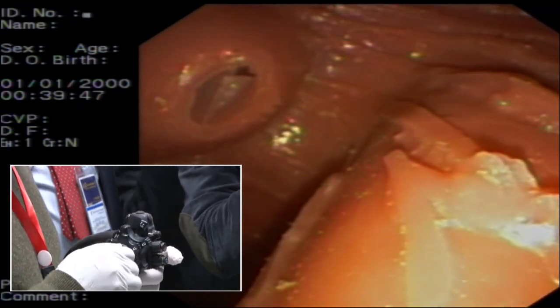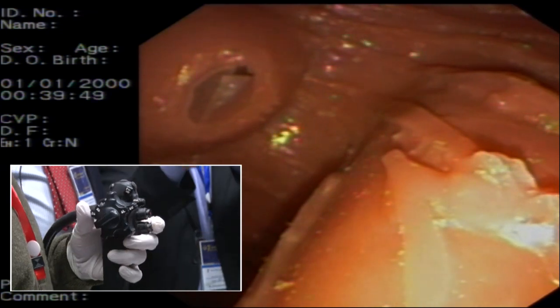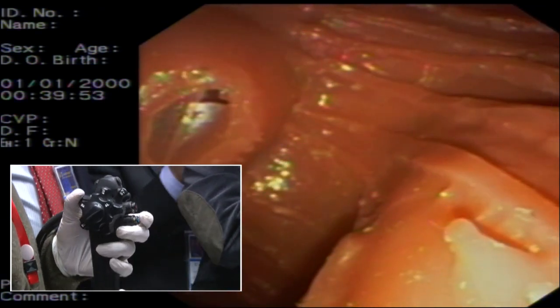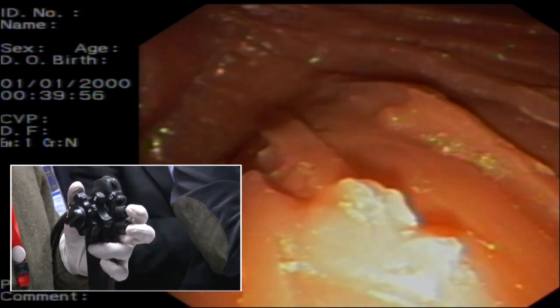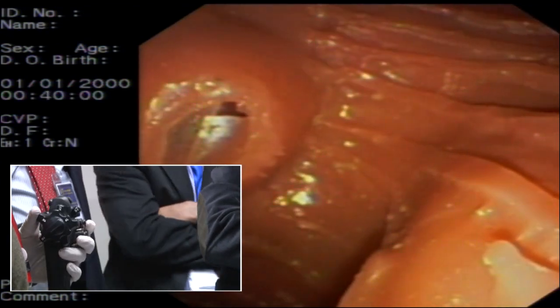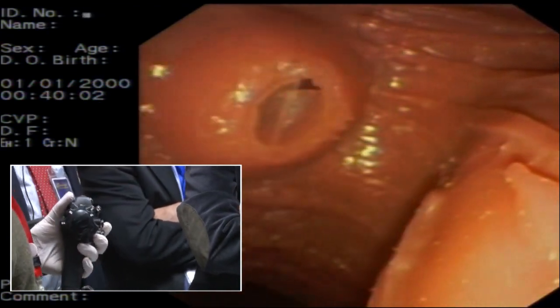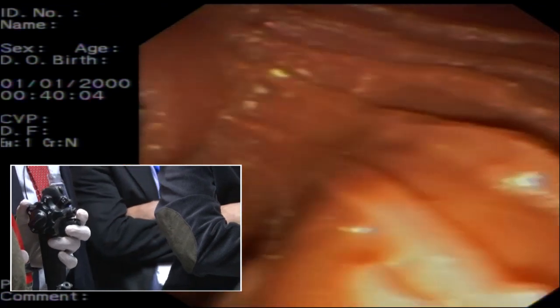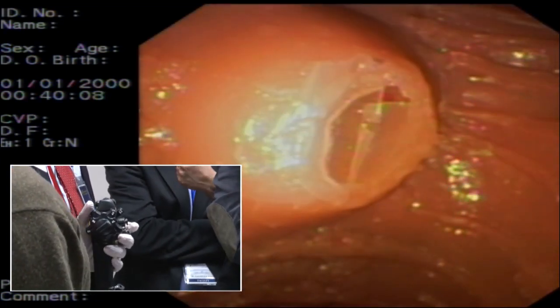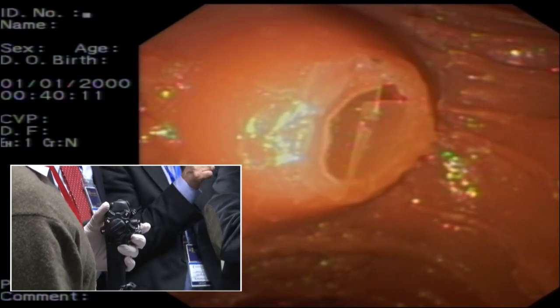Try to practice it like with the big wheel away from you, towards you, small wheel towards you, away from you, and see what that changes. This is how you are going to home in on the papilla. The rotation that you do of the scope actually changes the position, either with the wrist or your shoulders. You cannot just hold the scope there and move your shoulders.